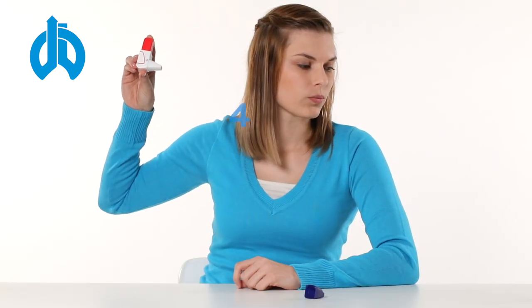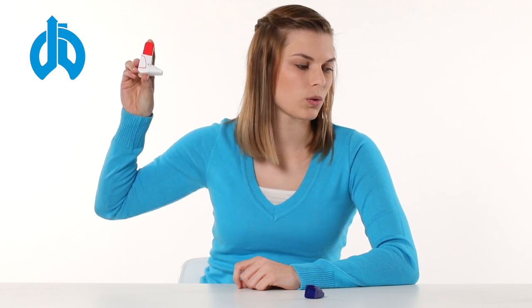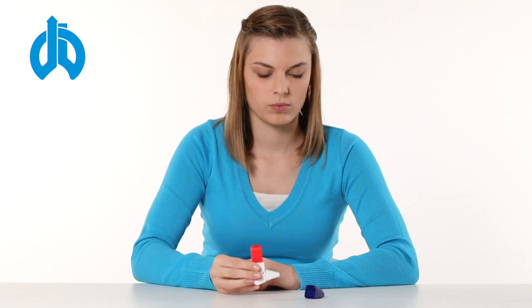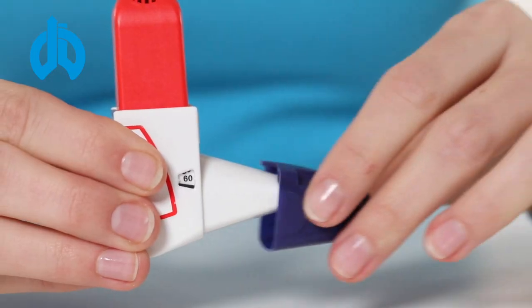Take the inhaler out of your mouth and hold your breath for at least five seconds, then exhale normally. If more than one dose per application has been prescribed, repeat the procedure. Then put the protective cap back on the mouthpiece after finishing use.